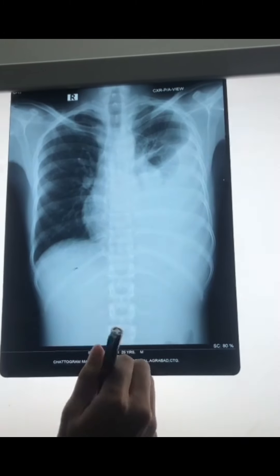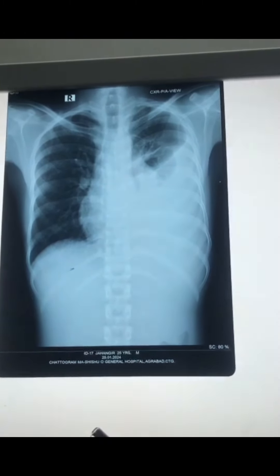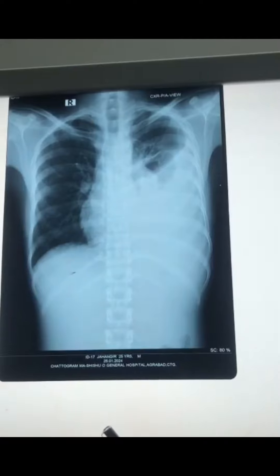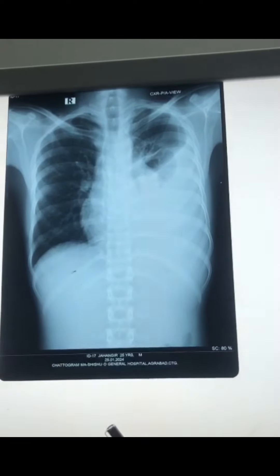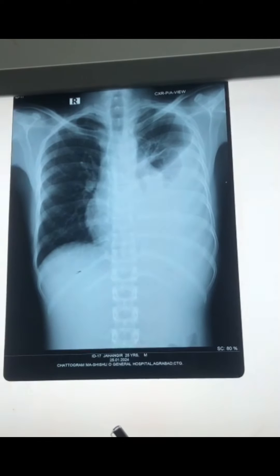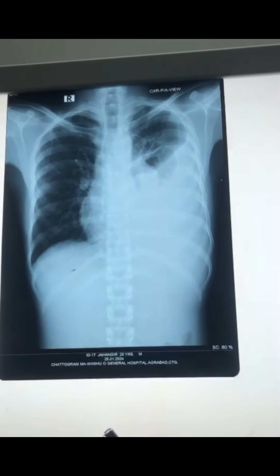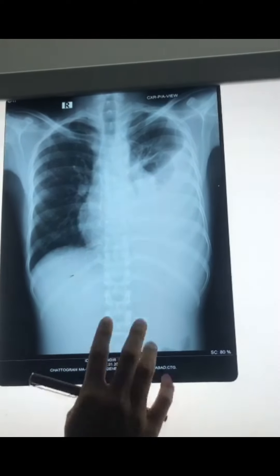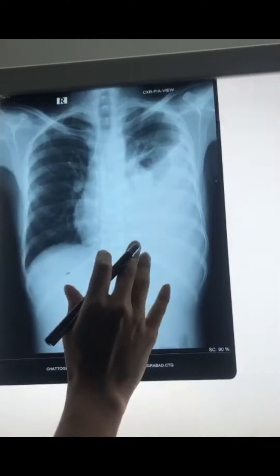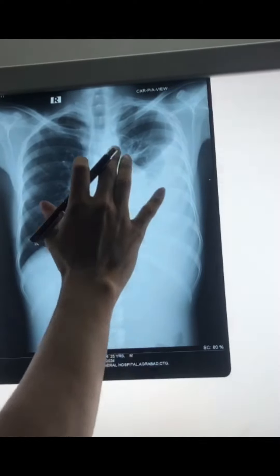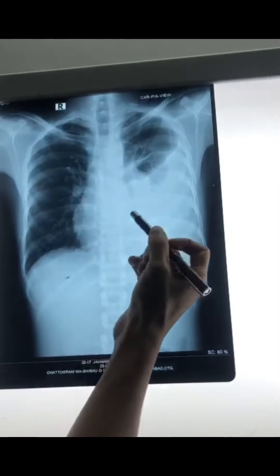Assalamu alaikum. I am going to describe this chest X-ray PA view. In this way, we start the interpretation of the X-ray.